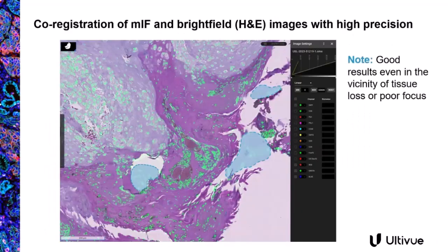And finally, here then overlaying the H&E with the first DAPI channel in bright green, and appreciate that the nuclei again are exactly overlaid, and the algorithm is not confounded by some tissue differences or some blurry regions, as noted here with the notations.